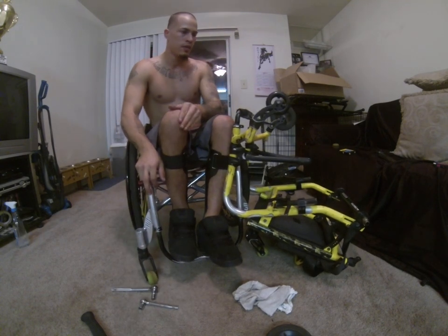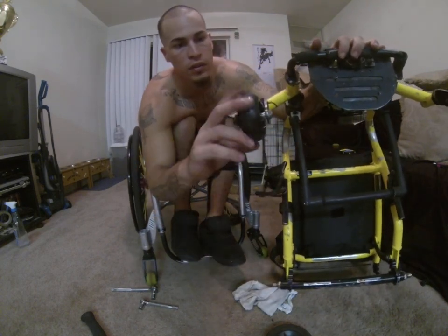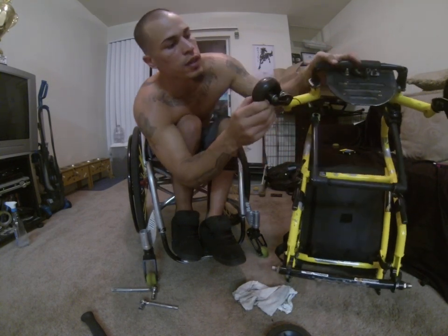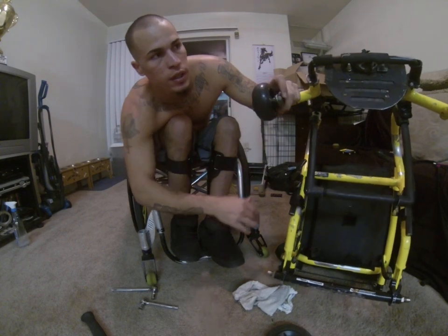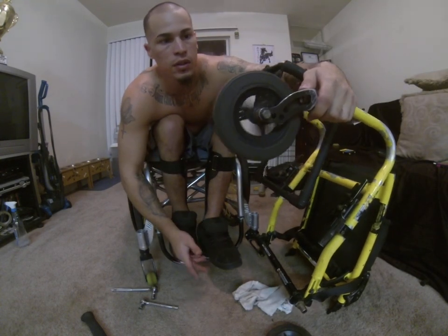Alright, so there it is. It's on there. It's good to go. This right here should give you a lot less caster flutter, and it's not gonna be all shaking everywhere and stuff like that. So if you have better bearings than mine that I have going on so far on here, you know, it should spin a lot better, kind of like this one. So this one spins really good.